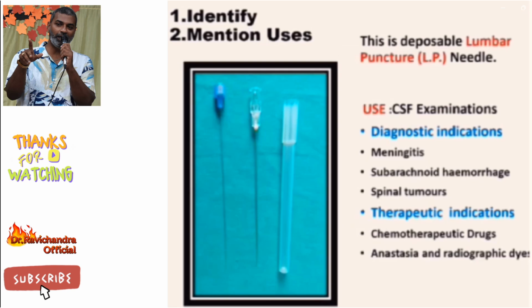LP needle or lumbar puncture needle. It is useful for CSF examination. CSF is useful in diagnostic and therapeutic purposes. So CSF analysis is done for meningitis, subarachnoid hemorrhage and spinal tumors, and it is also useful for therapies like chemotherapeutic drugs and radiographic drugs are induced into the body using these LP needles.